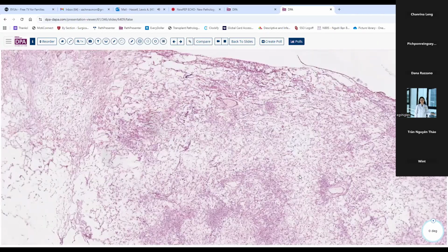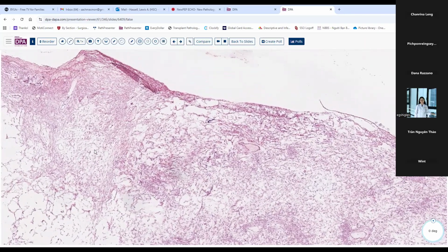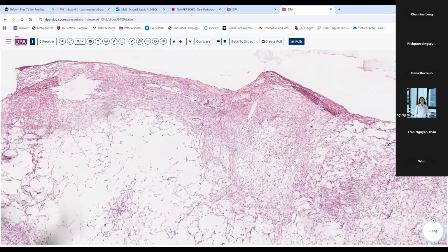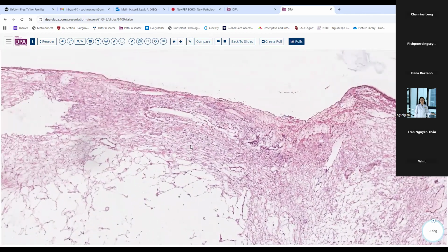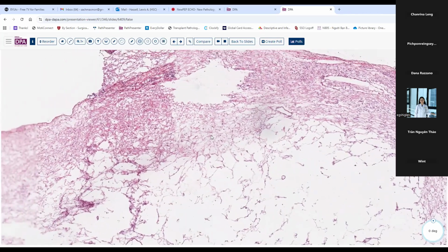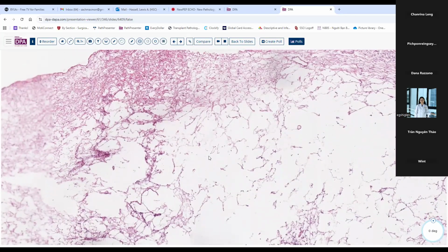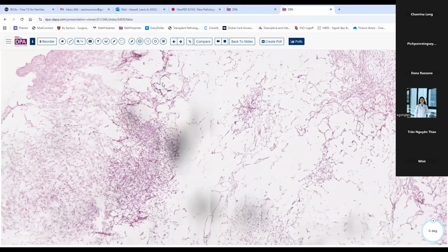This is a case that ultimately proved to be massive edema of the ovary. And typically what you look for in that situation is a peripheral rim along the cortex and subcortical area of somewhat normal structures. But we don't really see too much of that in this frozen section. And that was part of what made it difficult to totally exclude a sex cord stromal tumor.